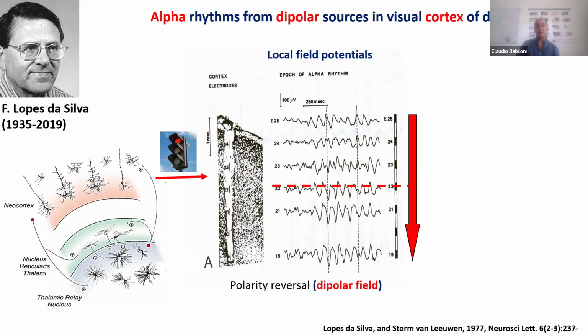intracerebral recordings. With an electrode within the cerebral cortex, the tip of the electrode is very small, and so you can capture the electrophysiological activity of a small number of cortical neurons. When you record scalp EEG, you have large cap electrodes with several millimeters of diameter, and you record from millions and millions of neurons.